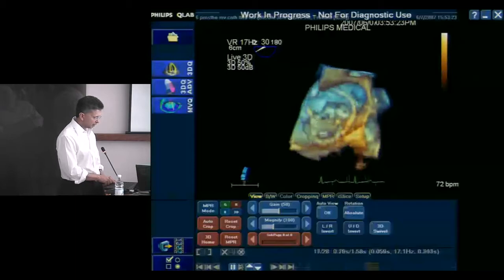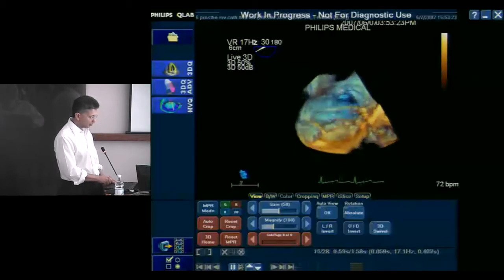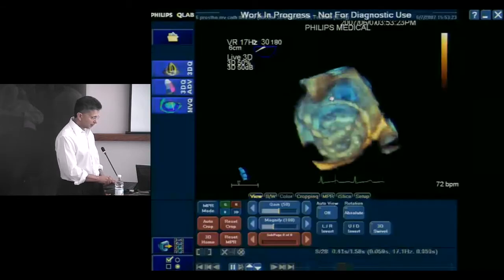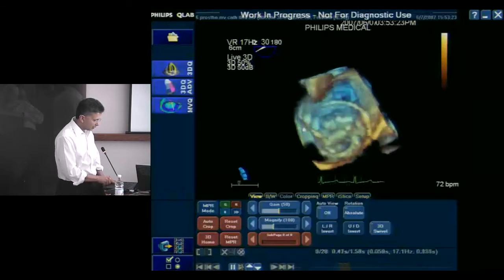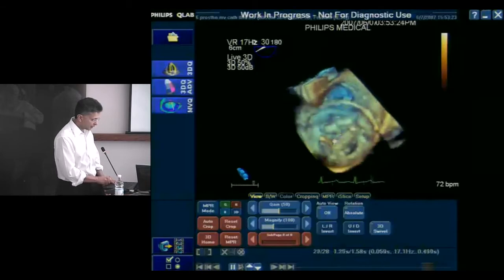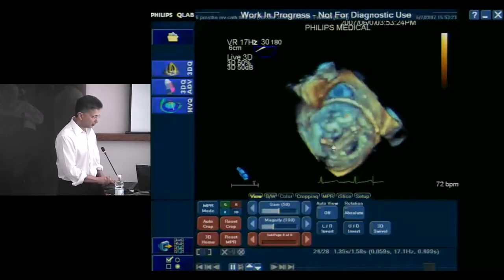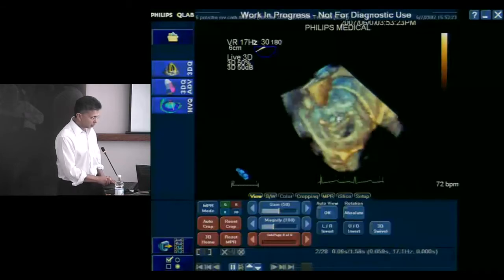Okay. So here we are guiding this. So this is the catheter going into the left atrium. We're looking at it. So this is the plane of the atrial septum, you see, and that's the appendage over there. That's the base of the mouth of the left atrial appendage. This thing here is a transseptal sheath. And the catheter going from the right atrium into the left atrium curves around there, and watch, there's her St. Jude's prosthetic mitral valve. These 2 things here are Amplatzer devices right next to each other. Okay? See the bileaflet opening away from you? It's beautiful, right? But now, so those were not the problem.